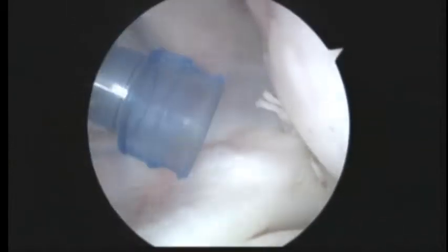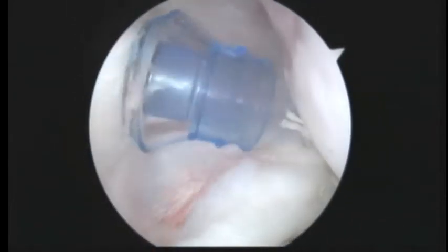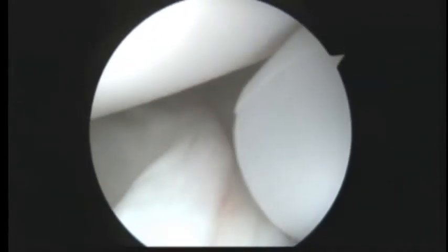So what that's done, hopefully, looks like it has, it's tightened this posterior part of the shoulder, and the rest of our work is really going to be in the anterior portion of the shoulder.